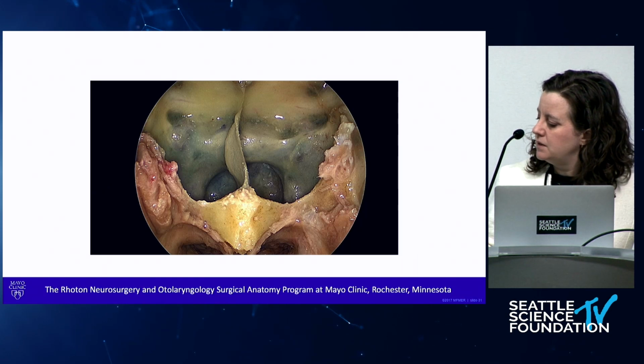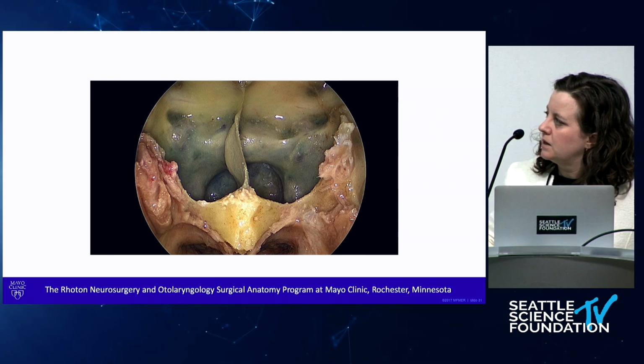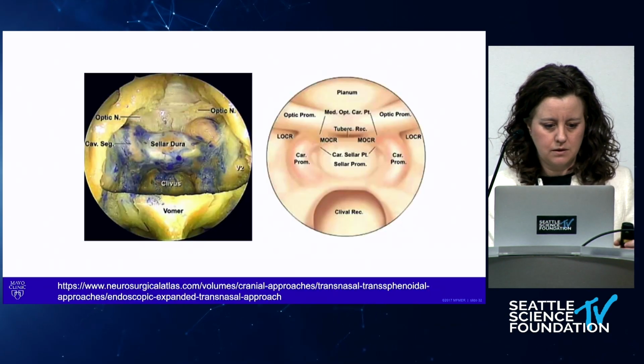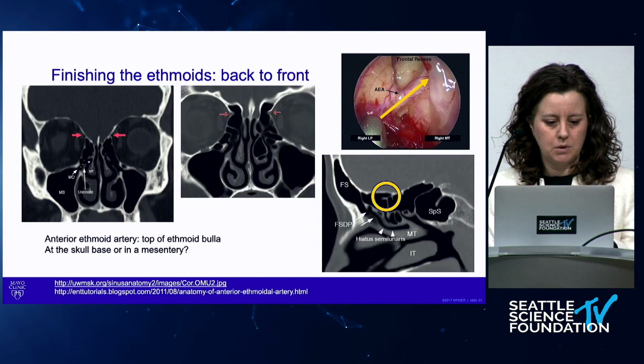I was asked to talk about the dangers in the sphenoidotomy. Again, from my partner Carlos, you're not going to have a sphenoid this big unless you're doing skull base, but the arteries are here. Obviously, if you're working in the sphenoid, optic nerve and carotid, no microdebrider goes back in this part of the sinus. And again, just to highlight the things we want to stay out of in a sphenoidotomy.